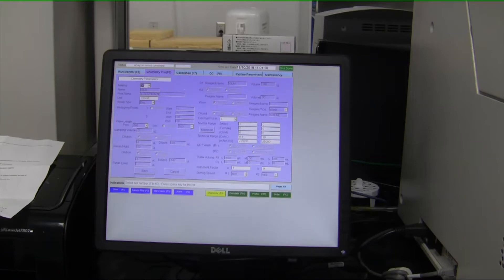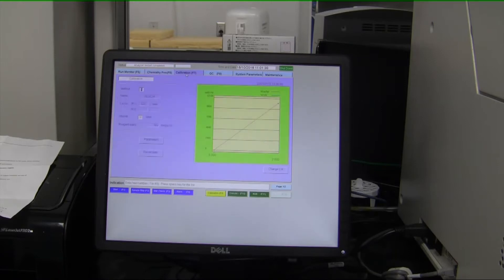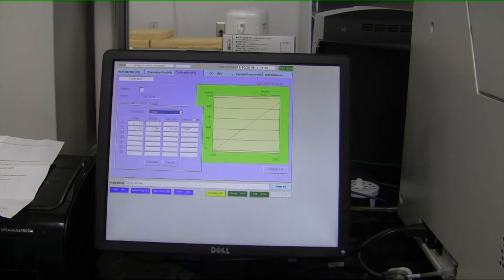Under Calibration, you'll have your calibration curves, and under Parameters, you're able to enter in your calibrator values.